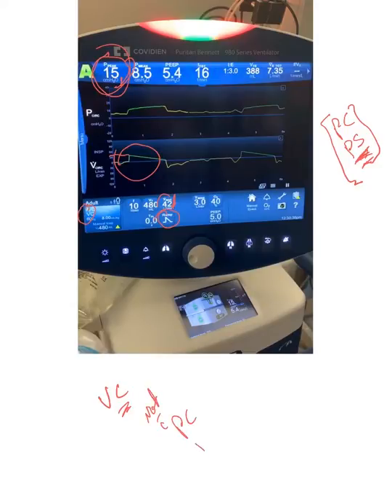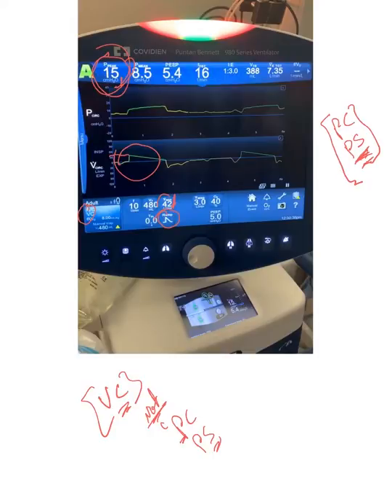So the issue with peak inspiratory pressure is mainly with volume control mode, not with pressure control or pressure support mode of ventilation. We'll talk about how to fix this when we troubleshoot ventilator problems — among them the peak inspiratory pressure — where we can play with the settings to lower the peak inspiratory pressure.